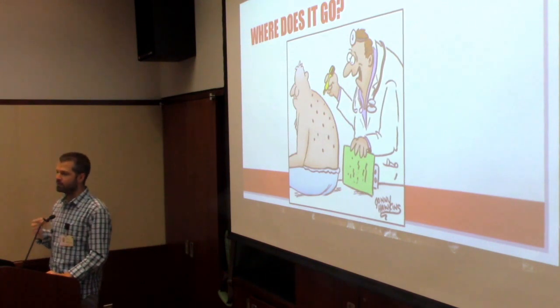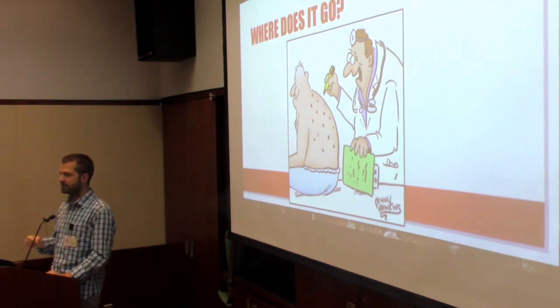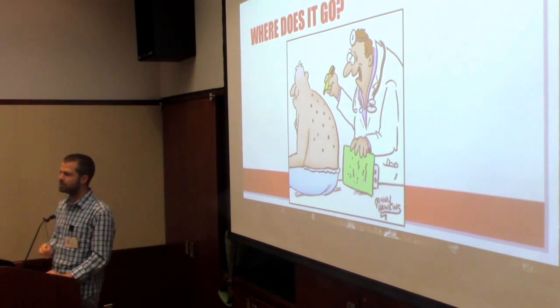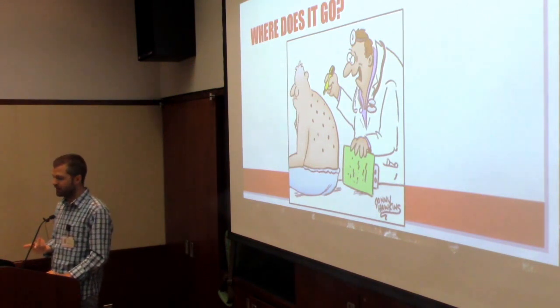I'm amazed the number of times I see lines placed in parts of the body that have a local infection. It happens much more often than I thought it would, or there's some sort of skin lesion on the top where I probably wouldn't want to be introducing that into the body, and it happens a fair amount.